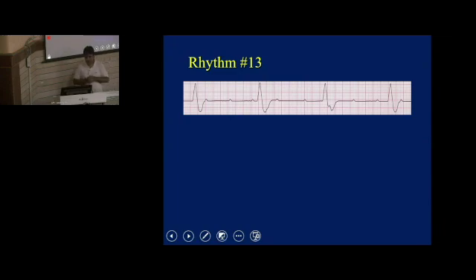Now coming to this ECG, what is the problem here? What is the rhythm? Almost normal rhythm. And the rate? Calculate the rate. 1, 2, 3, 4, 5, 6, 7, 8. 300 by 8. So heart rate is between 30 to 40.